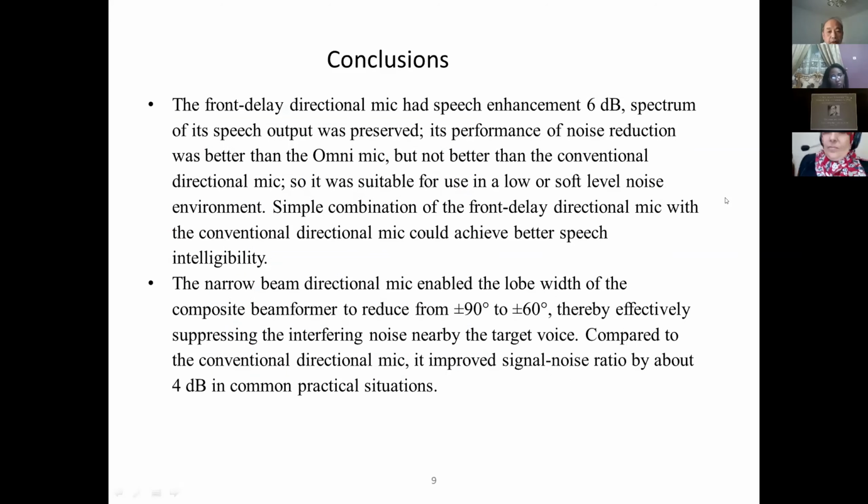Now we have conclusions. The front delay directional mic had speech enhancement of 6 dB. The spectrum of its speech output was preserved. Its performance of noise reduction was better than the omni mic, but not better than the conventional directional mic.